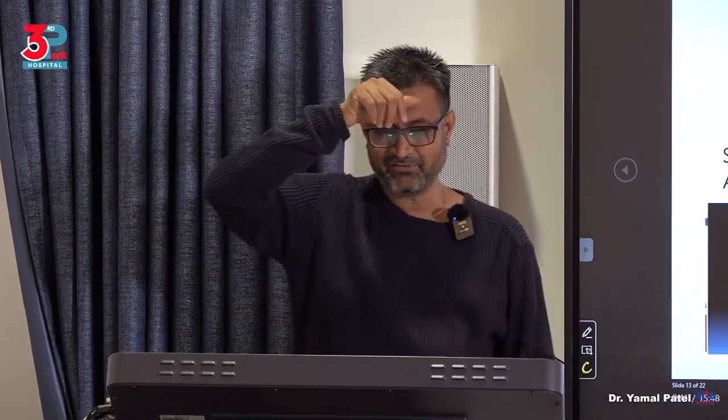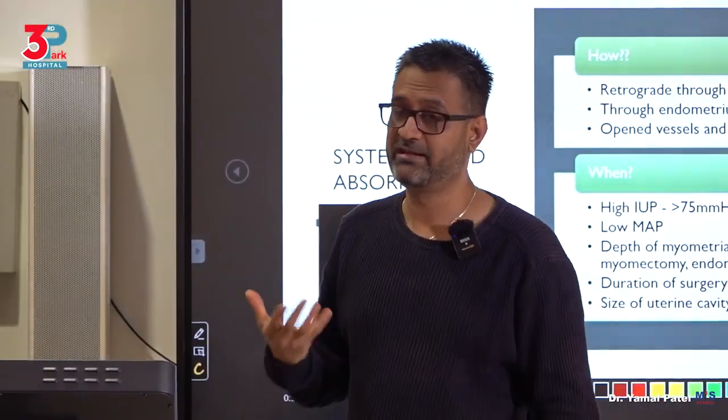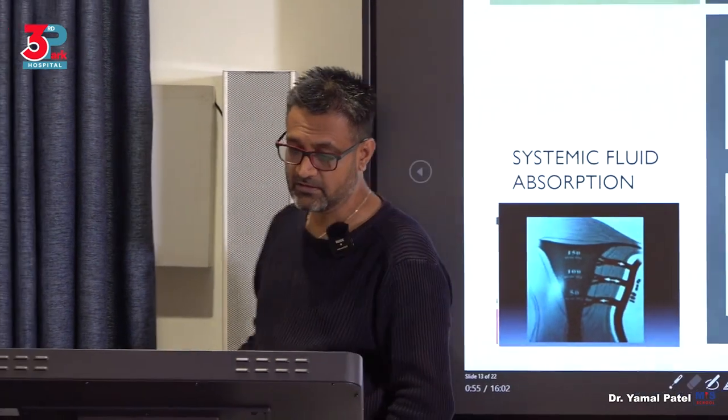The second one, it will get absorbed through the endometrium because it's a direct contact and it pushes it in. Or if you open up the myometrium, through those major vessels that are in the uterine cavity, through the vessels. So this is how this fluid is getting absorbed. When does it happen?